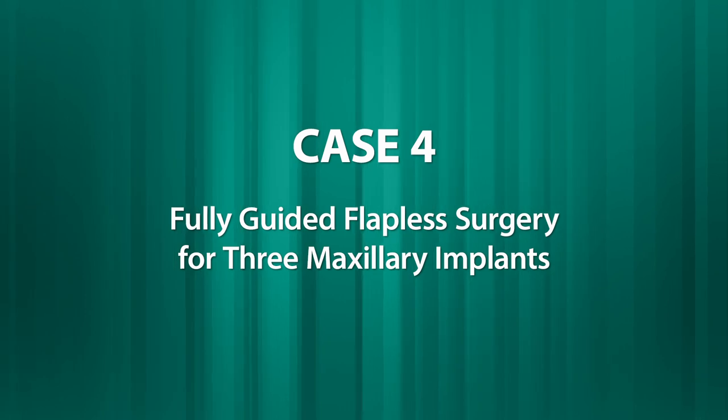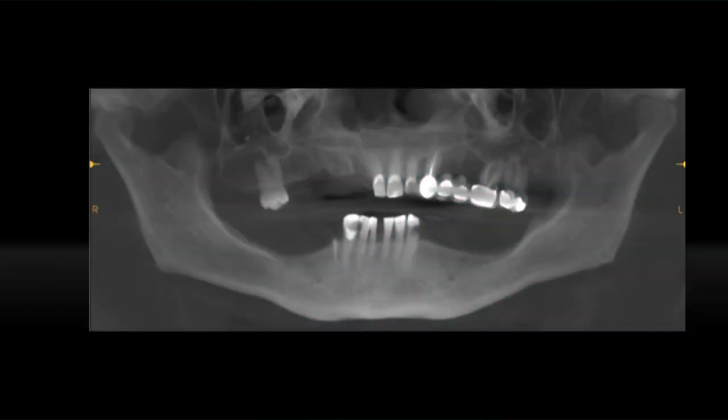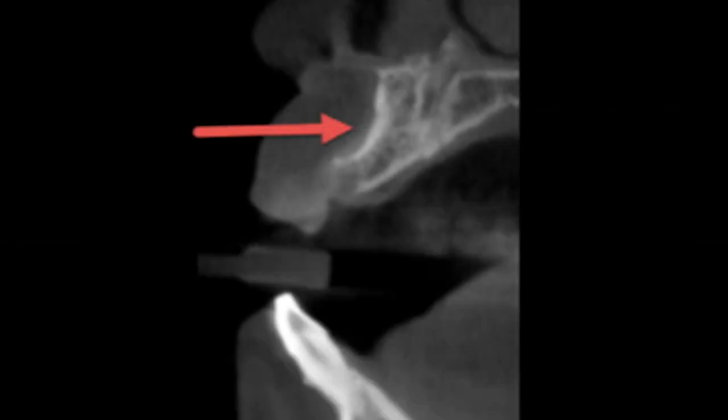In the next case, case number 4, we are going to show the fully guided surgery through a flapless approach. So we have a 55-year-old lady who is medically fit and well, presented to replace missing posterior teeth. The plan is to perform a fixed restoration on the upper right side as a part of a comprehensive treatment plan. The patient has buccal bone deficiency at site 1-2.